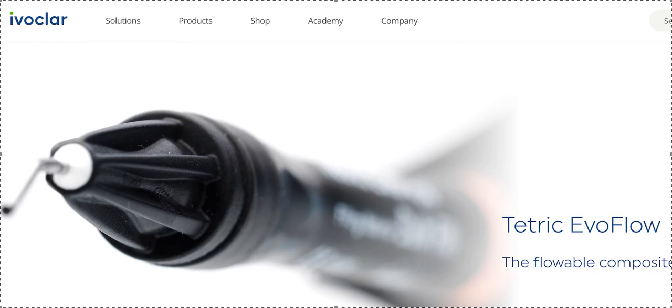The problem with traditional flowable is that it makes a mess. If you have flash that comes off, the aligners aren't going to seat ideally. This is probably one of the biggest mistakes I see a lot of doctors making — too much flash, they don't get it off, it gets messy. The aligners never quite seat properly, and because of that you have tracking issues and they end up going through refinements, refinements, refinements, when really the only issue was that they didn't do the attachments perfectly.